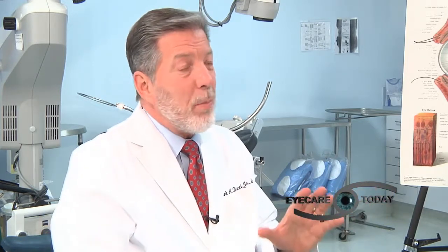So how long has the iStent been FDA approved? I think it was approved last year at some point, and then has moved along. It's gaining popularity, and I've been watching it and studying it and making sure the results are good. And now there are really very sound reports coming out. One report showed the average number of medications was about 2.6 in a group of 100 patients, and it went down to 0.9. So kind of 2.5 meds to 1 med. And the average lowering in pressure was about 3.5 points per patient.